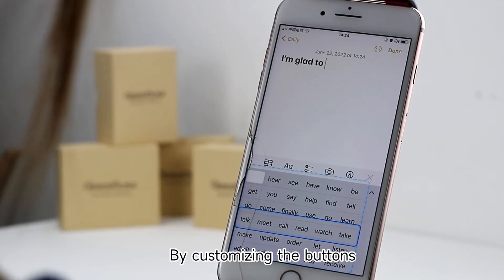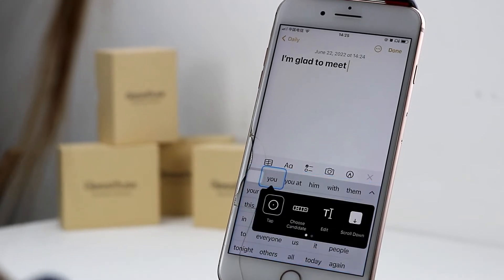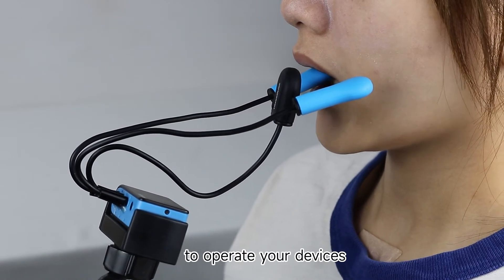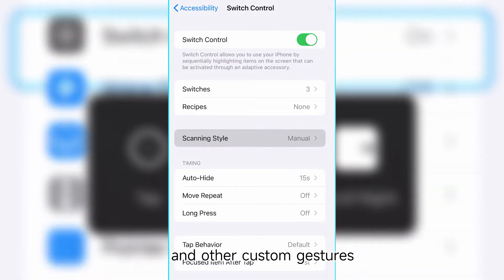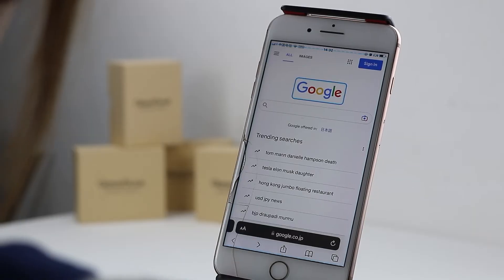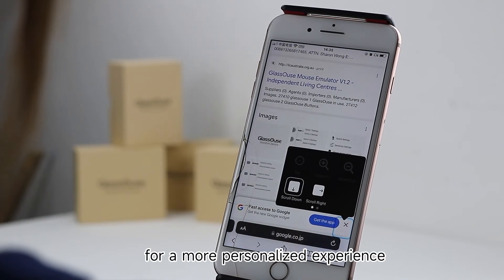By customizing the buttons, we can easily control the options and daily use. Switch mode doesn't rely on using the mouse to operate your devices; instead it supports point scanning and other custom gestures. In essence, it allows you to visit websites, set hold duration, and even use the menu bar for a more personalized experience.